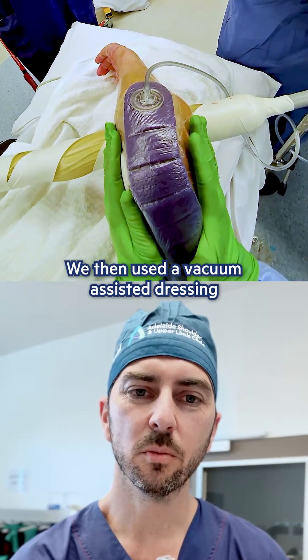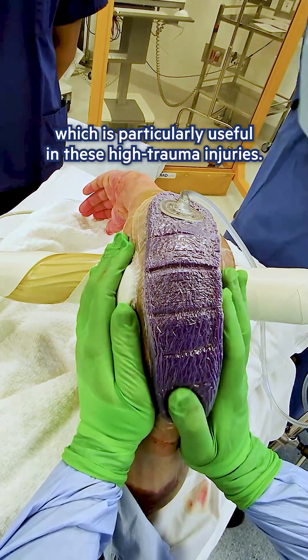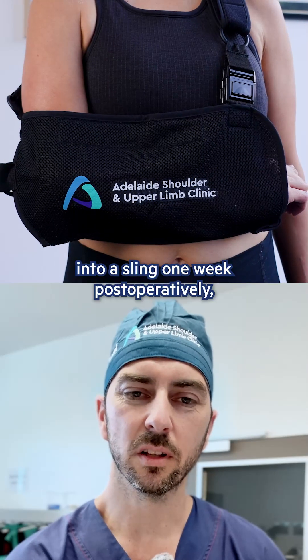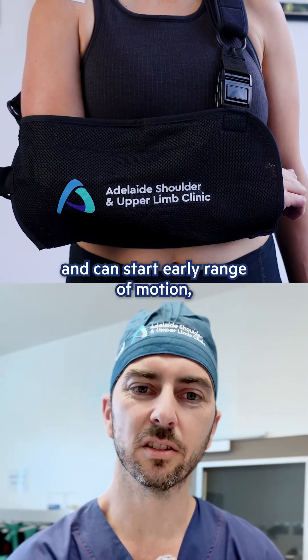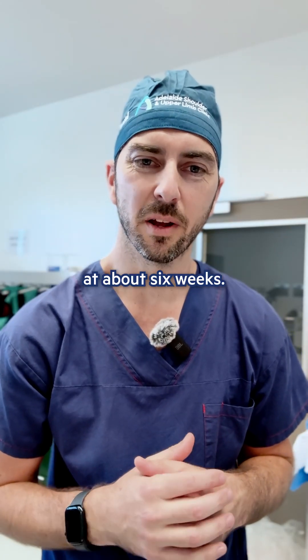We then used a vacuum-assisted dressing at the end of the case to help with any excess ooze, which is particularly useful in these high trauma injuries. We then get the patient into a sling one week postoperatively, and can start early range of motion, then gently bring in strengthening exercises at about six weeks.